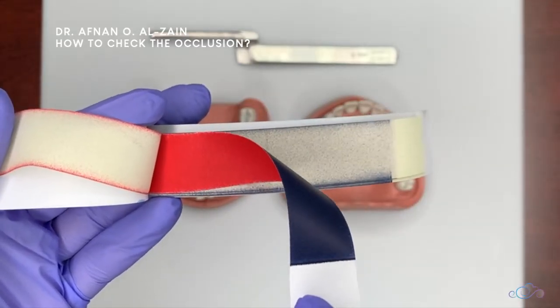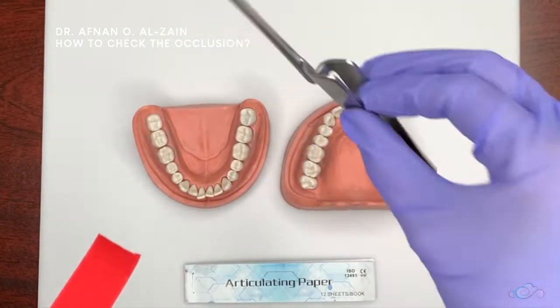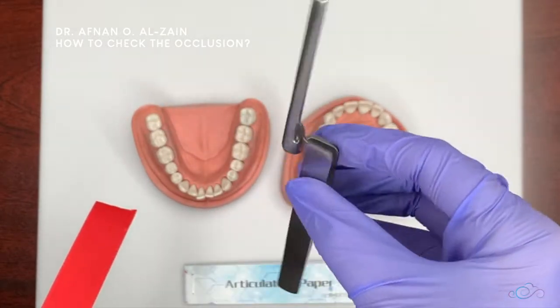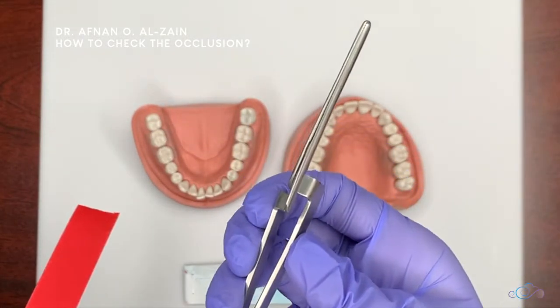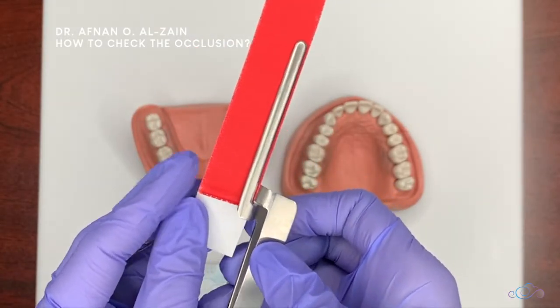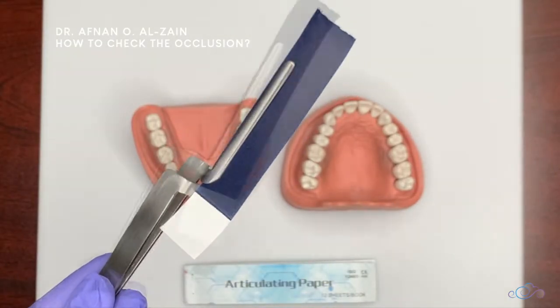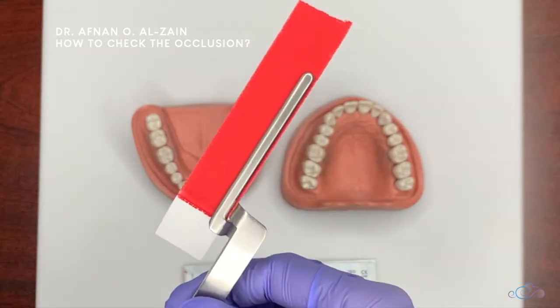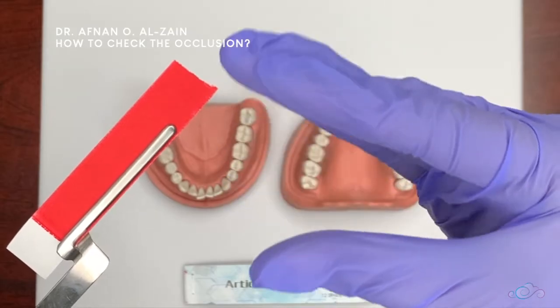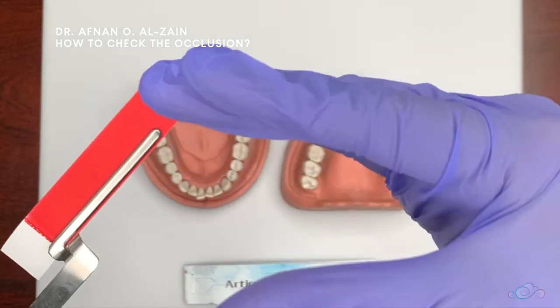We're going to explain why it is important to have both colors when checking occlusion. We take one paper, and then we have here the articulating paper holder — they're like tongs, so you push it to open it and then place the articulating paper inside.